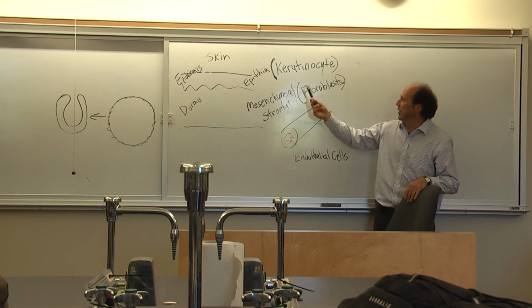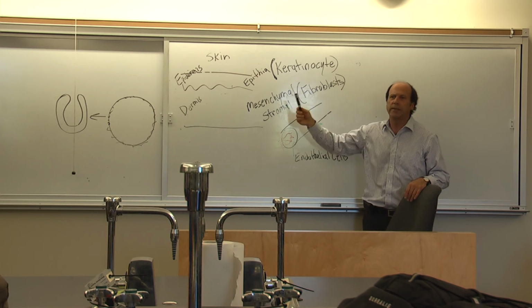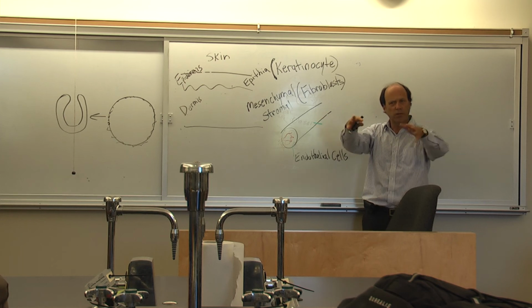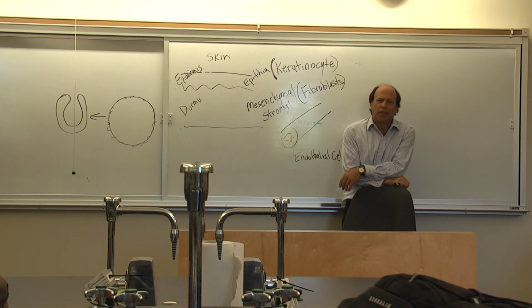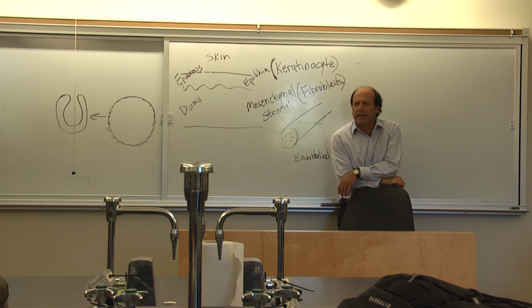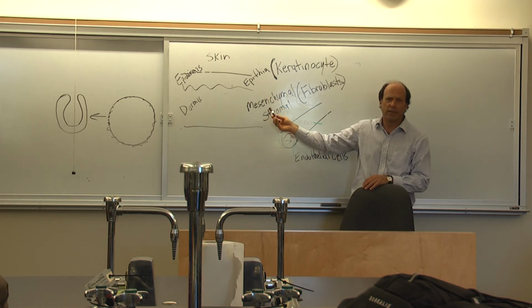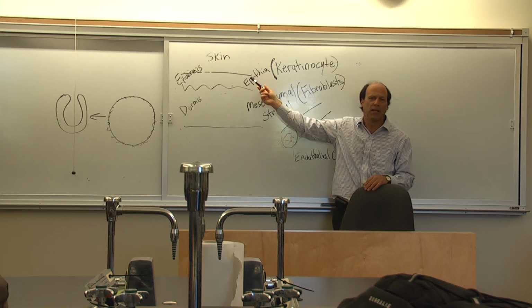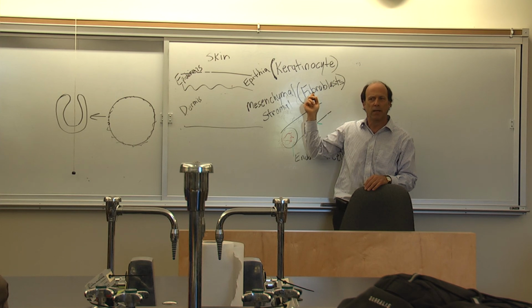Then we're going to make a movie, of both a keratinocyte culture and a fibroblast culture. We're going to add trypsin EDTA to them, and the cells are going to start to peel off the plate. You've seen that before, right? But what's the purpose of this lab? Remember I said that on quizzes I'd love to ask, what was the reason we did that? We did something, we saw something, we concluded something, so what's the lesson you learned from that? We're comparing these two different cell types. The key is the comparison between what you see in an epithelial cell when it's trypsinized versus what you see in a mesenchymal cell, these fibroblasts, when they trypsinize.